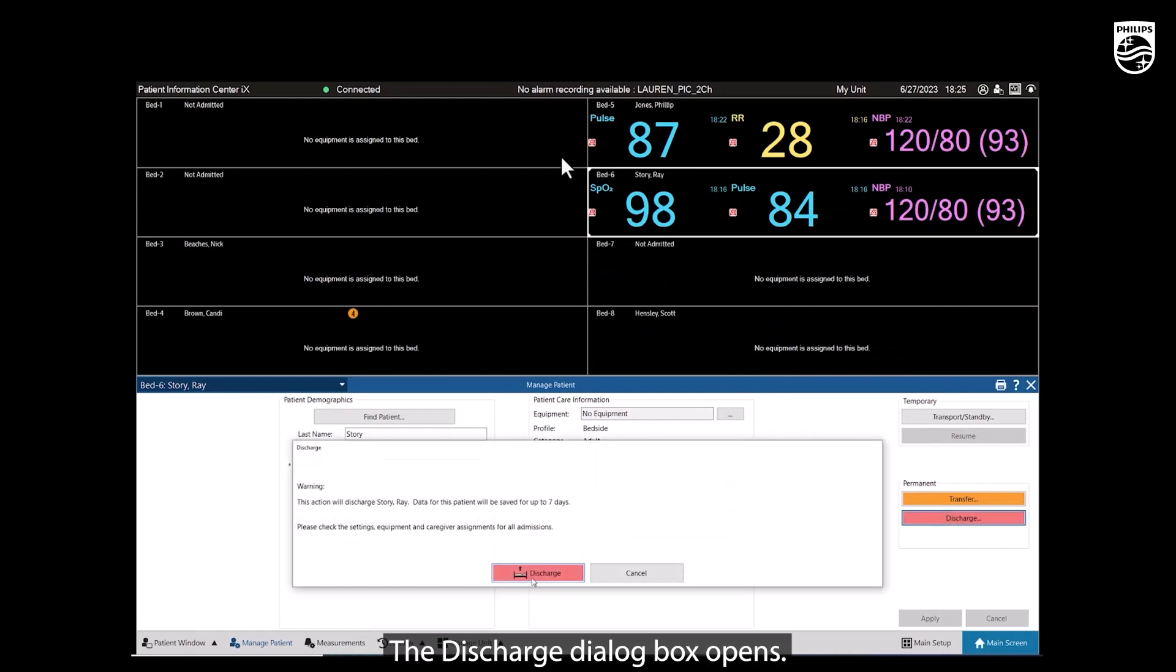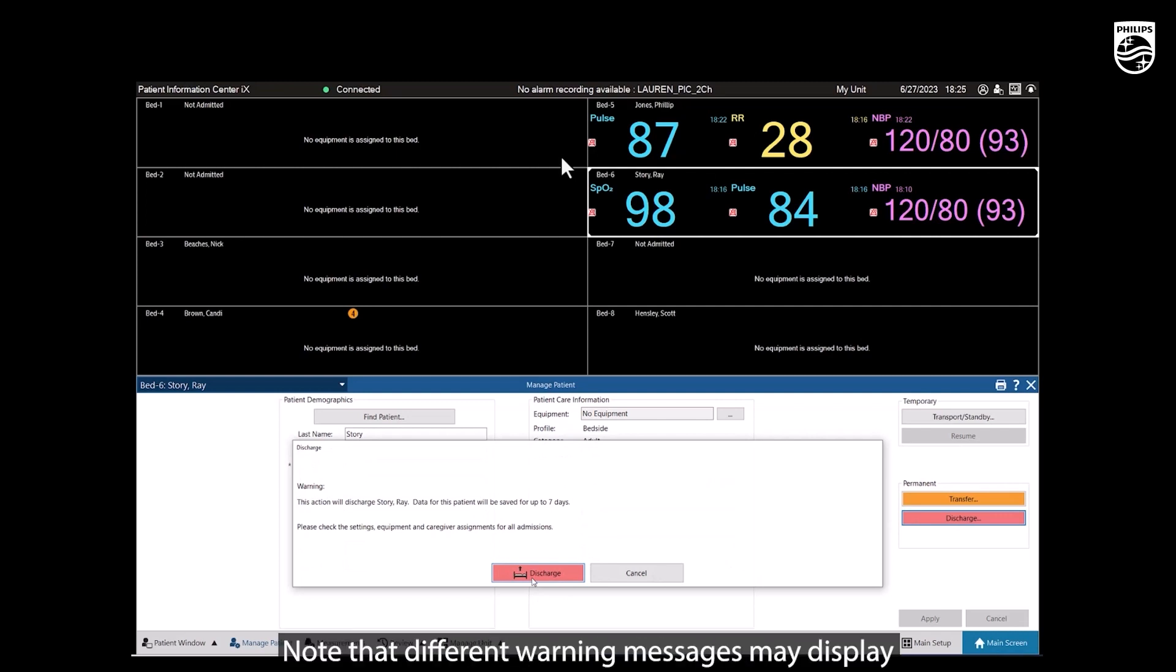The Discharge dialog box opens. Carefully read the warning. Note that different warning messages may display depending on the configuration.